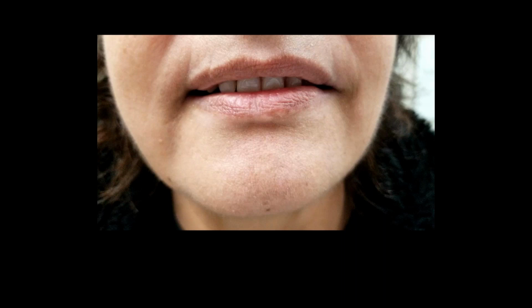I've taken our normal words that we use, 66, Mississippi, days of the week, months of the year, and not only am I looking at the aesthetical value, but now I'm looking at the jaw tracking and the teardrop and the three-dimensional teardrop. So not only does it move vertically, but within the horizontal space. And now I'm able to modify the teeth. And then VITA teeth aren't locked together, so I have a little bit of flexibility. Now they're acrylic glass so that I can grind them without damaging them. And I'm able to modify that to the patient.